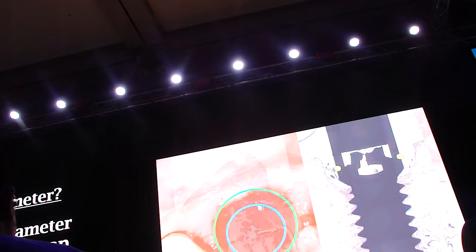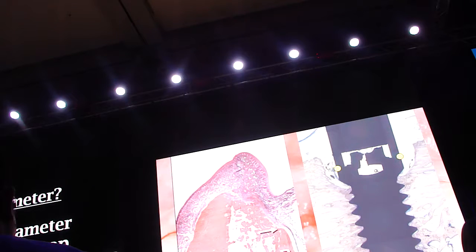The second thing is the fear of the bundle bone resorption, and that's independent of the implant system, because after every extraction, we should be prepared to lose some bone due to that bundle bone effect. I don't want to go into details because all of you know this. Jan Lindhe has done tremendous research on this topic with his group in the last 10 years. So that's something independent of the implant system that you have to keep in mind.